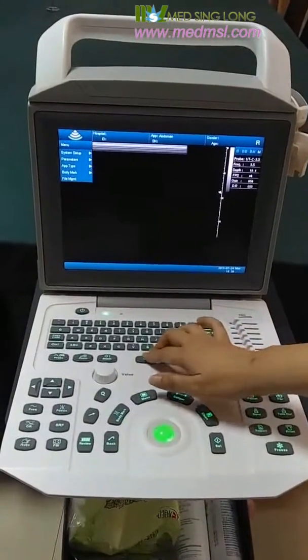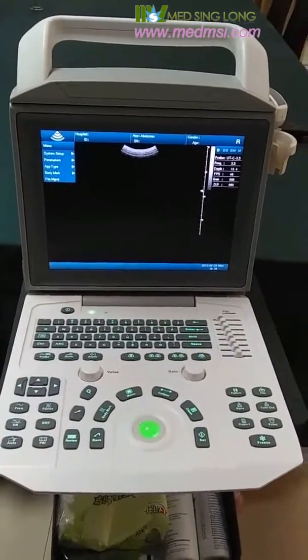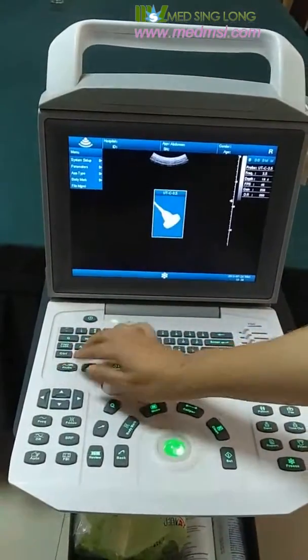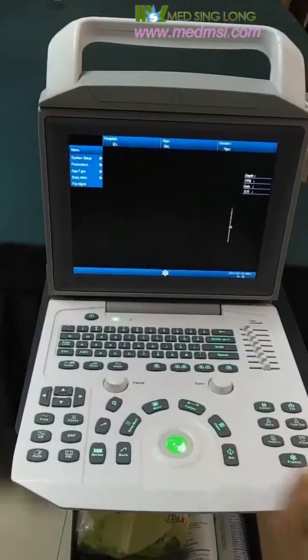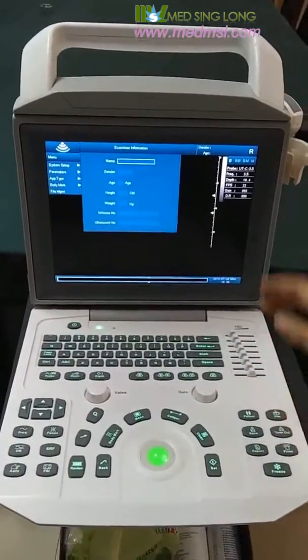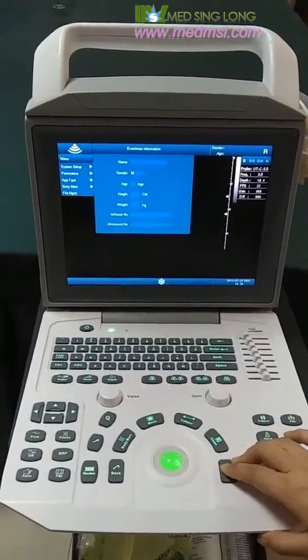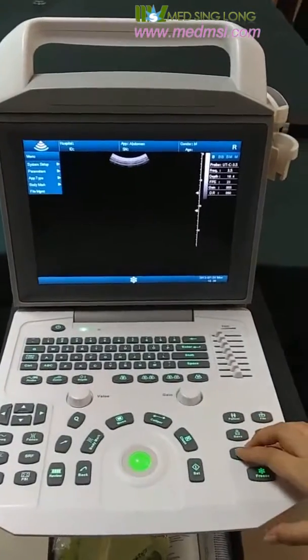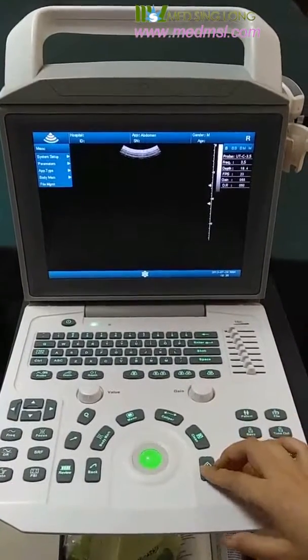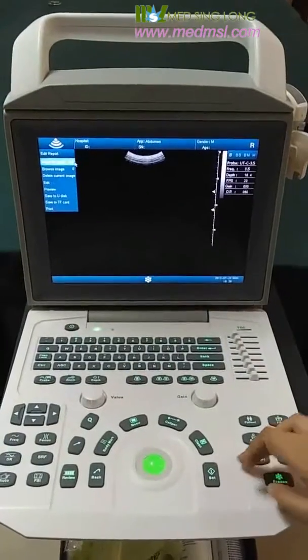Now we come to B mode to examine a patient. We just need four steps. First, we choose a probe. Second, we input the information of the patient. Then, we perform the examination. And then, we generate the report and save the images to the report.